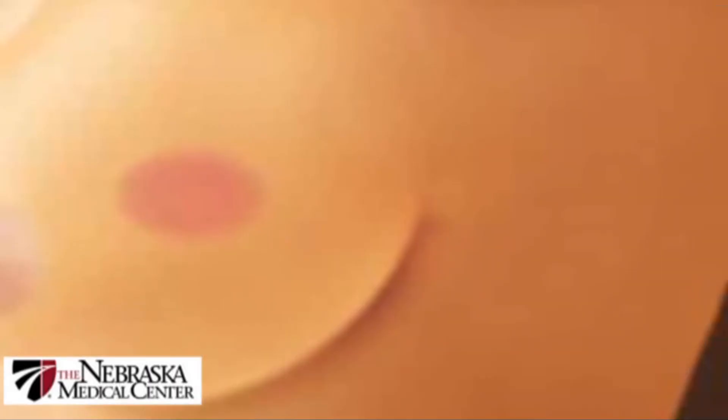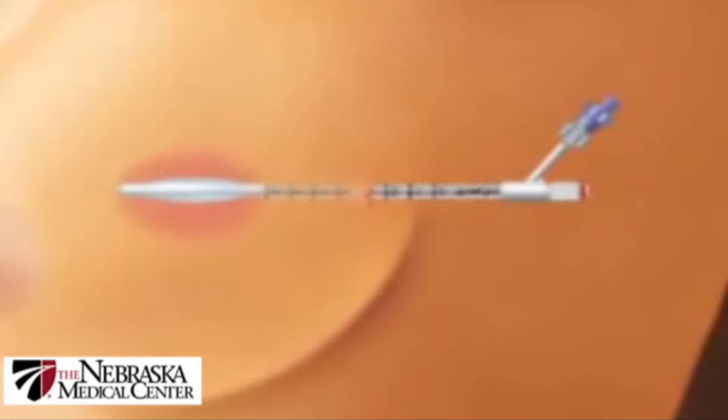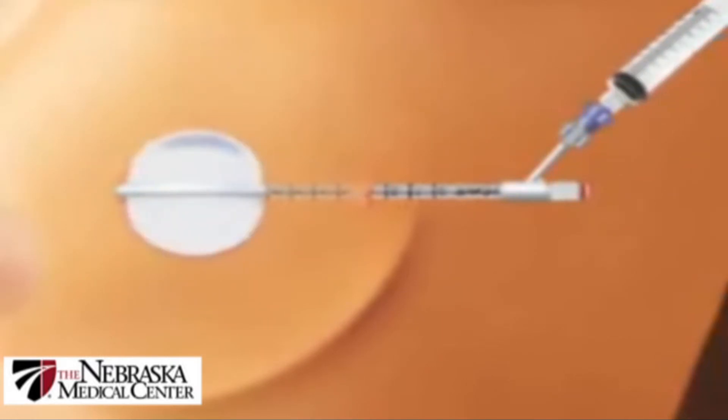In many of our patients, the nice thing about this approach is that we can actually move the probe around the maximum point of radioactivity to design a more uniform sphere, which allows us, in fact, in many of these patients to proceed with another treatment, namely the MammoSite. The cavity for the MammoSite is a cavity which needs to be as close to a sphere as possible to allow these patients to perhaps complete the radiation therapy using the MammoSite treatment, which is the accelerated partial breast radiation, in five days instead of five weeks. So the shape of the lumpectomy, which can be more spherical using this approach, is more favorable for the placement of this device, this balloon, which allows more of those patients to perhaps complete the radiation therapy in five days instead of five weeks.